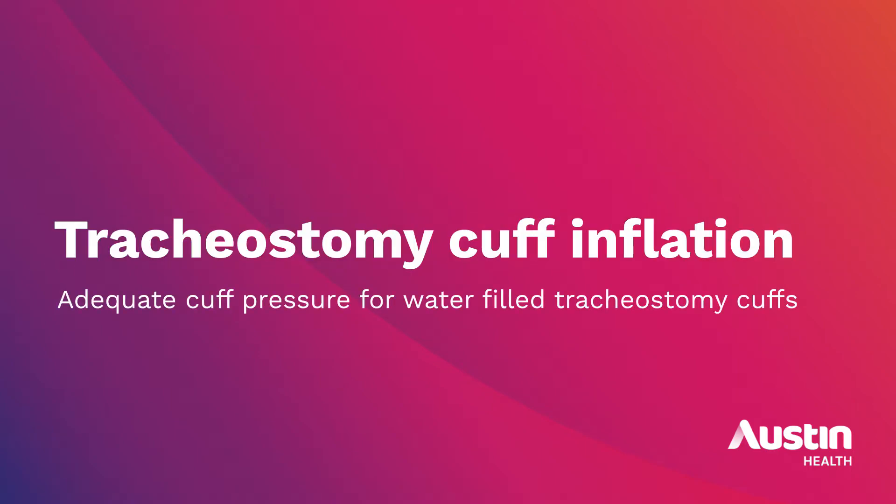In this video we will demonstrate cuff inflation for water-filled tracheostomy cuffs and the minimal occlusive volume technique to establish the amount of water required to achieve a cuff seal. This video should be used in conjunction with the OPIC tracheostomy cuff management clinical procedure.